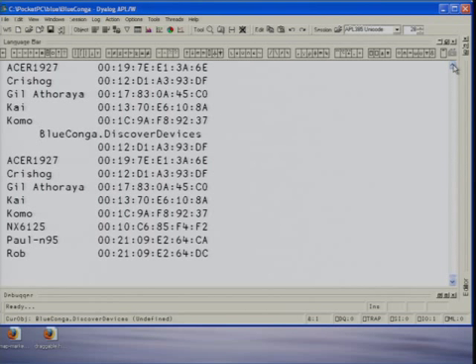So I've got a similar Bluetooth application on my smartphone that I use to mimic the sensor. So this, in our experiment now, will be the Bluetooth sensor to measure the heart rate. And I'm running it as a server, so it will just wait for my PC, which is acting as the smartphone. It's very confusing, this. This Bluetooth sensor, biosensor, and this smartphone. It's a little bit difficult to show everyone on this little screen, that's why.